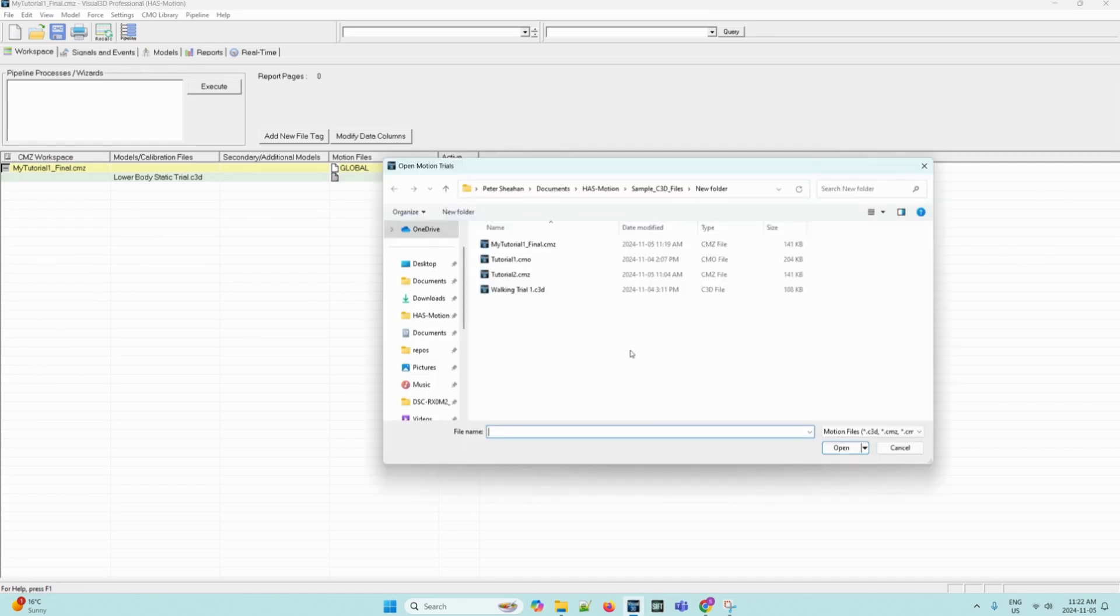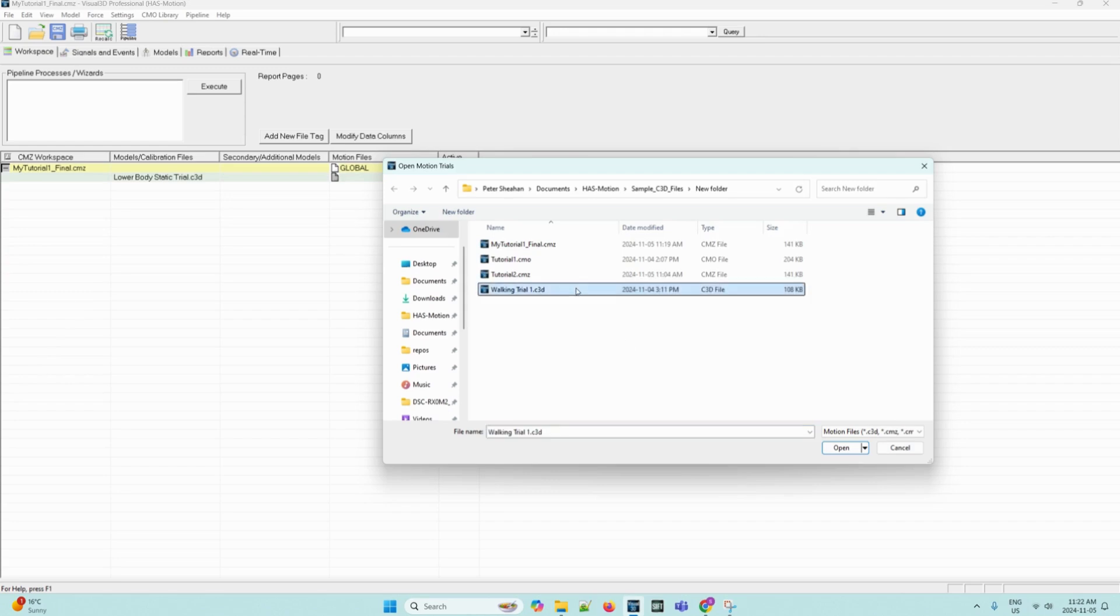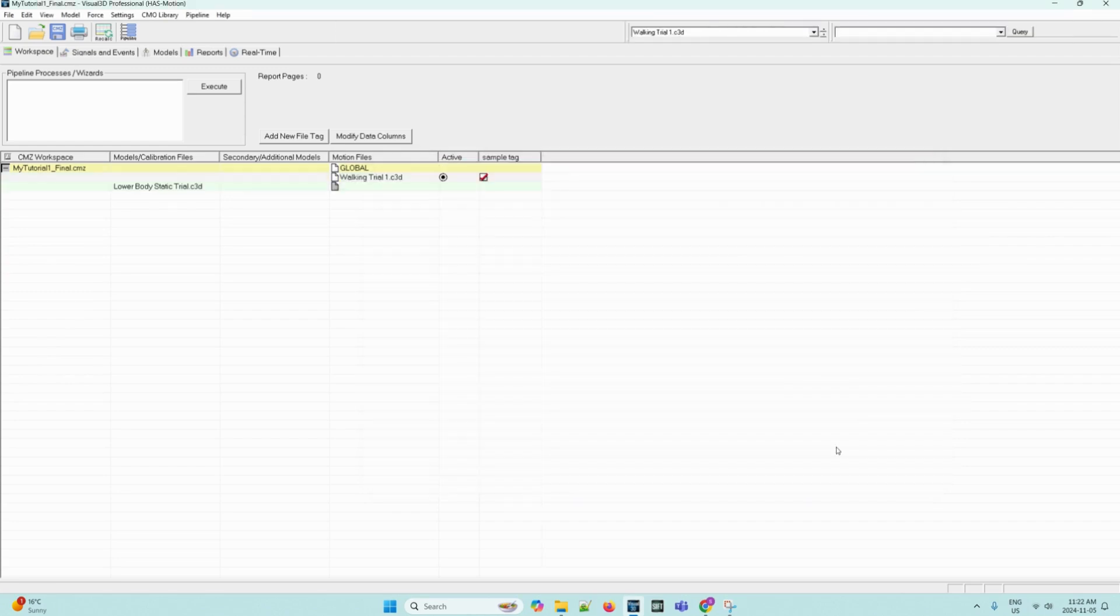Now, we can navigate to the location of the walking trial that you downloaded for this tutorial, named walkingtrial1.c3d. We can select it and click open. Now we can verify that the model file appears in the column labeled motion files, which it does.